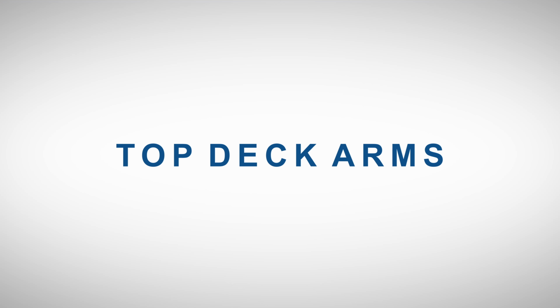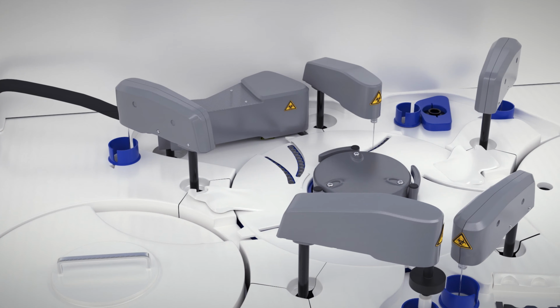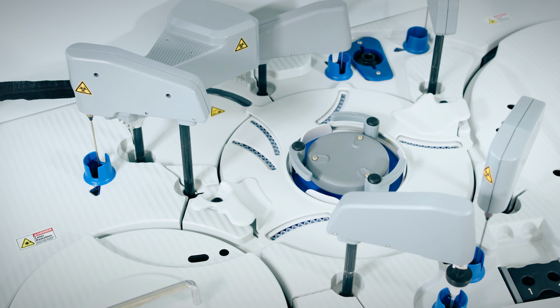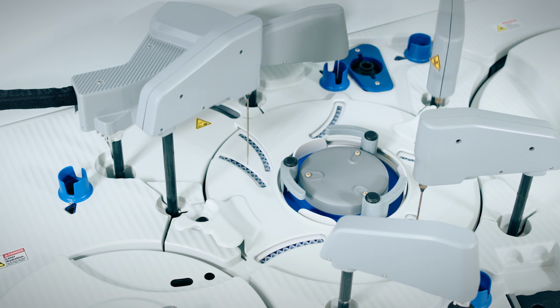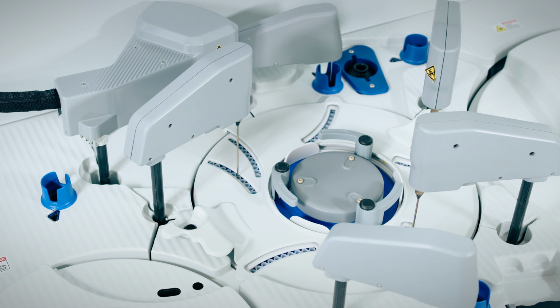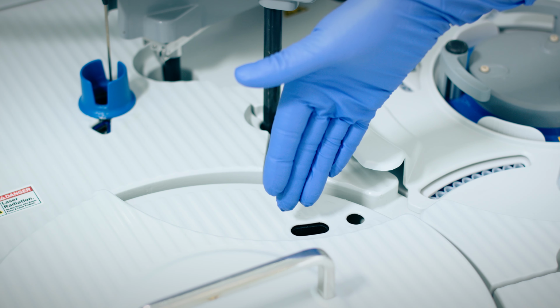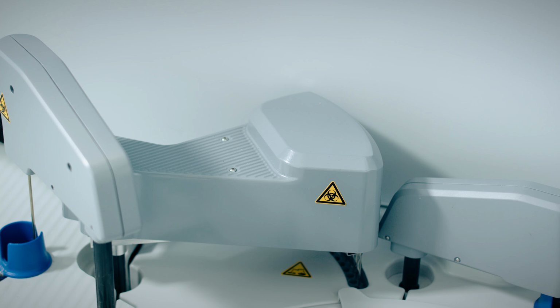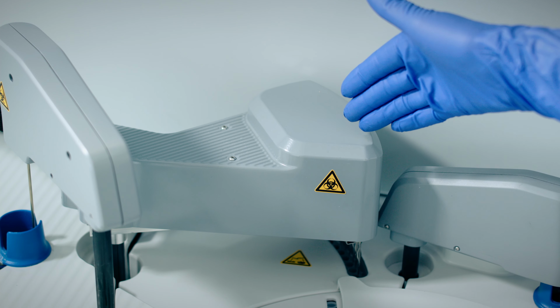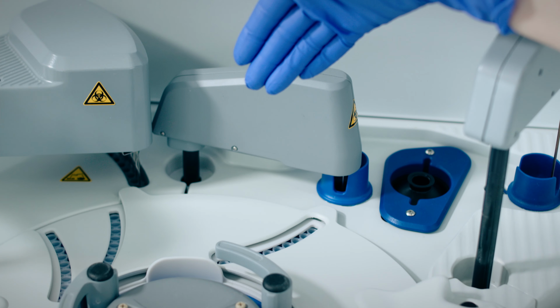Top deck arms. The top deck also features 6 different arms, which have various features to facilitate the automated ELISA. The single probe arms are responsible for pipetting samples and reagents into the cuvettes. They feature liquid level detections, as well as an automated mixing mechanism. This is the sample arm. It pipettes the samples from the sample rotor to the reaction rotor. Here we have 2 arms that wash the cuvettes throughout the course of the assay: the multi-rinse arm that does 10 cuvettes at once, and the mono-rinse for single cuvette washing and stopping the reaction.